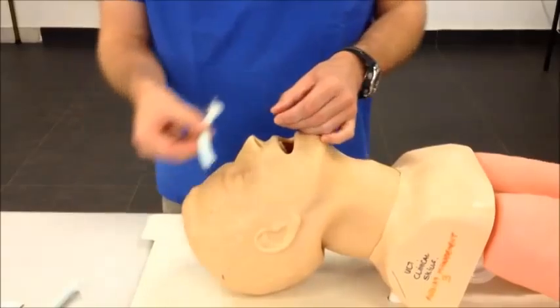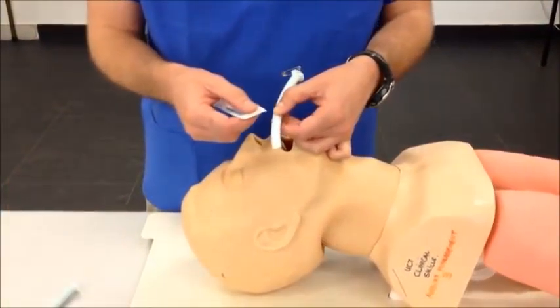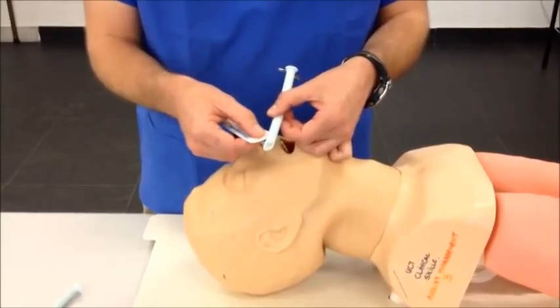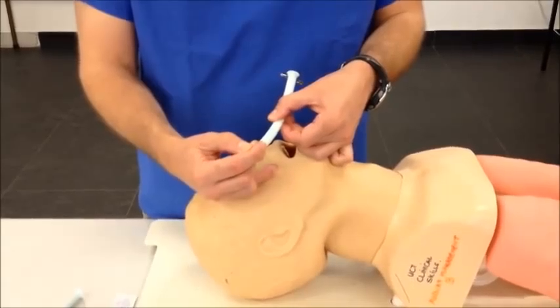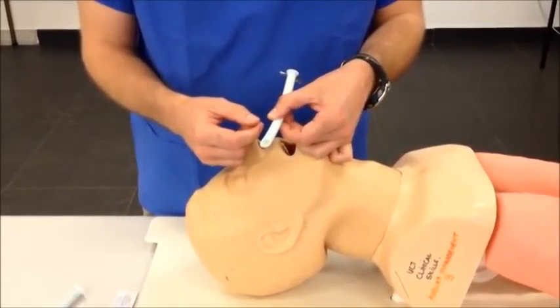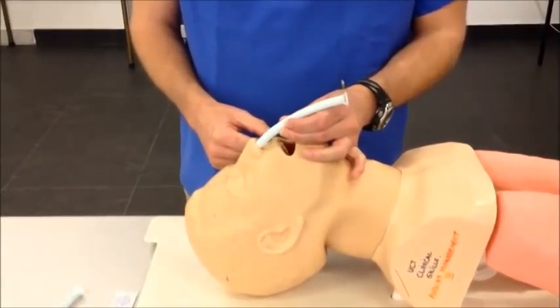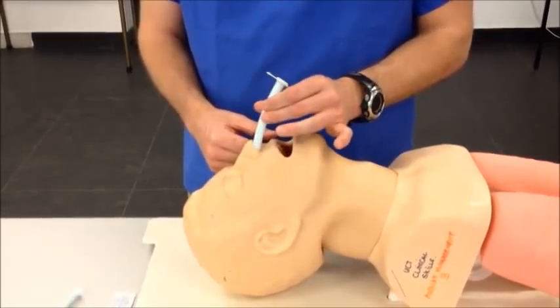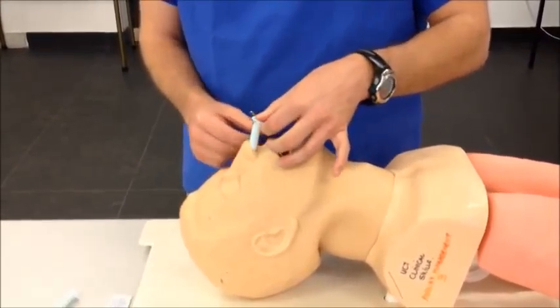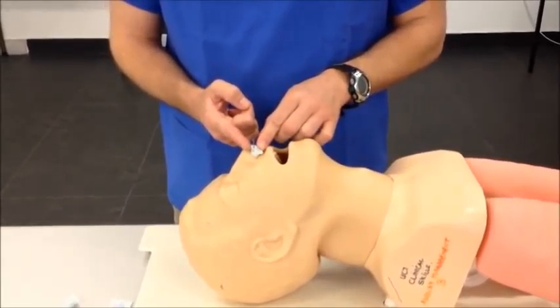Before inserting the nasopharyngeal airway, consider applying a water-based lubricating gel to the distal end of the nasopharyngeal airway, taking care not to get any of the gel into the tip, as this would cause airway obstruction. Insert it into the nostril by initially going upwards and then angling it towards the floor, and with a gentle rotating or twisting motion inserting the airway into the nose. The flange of the airway should rest at the nostril.